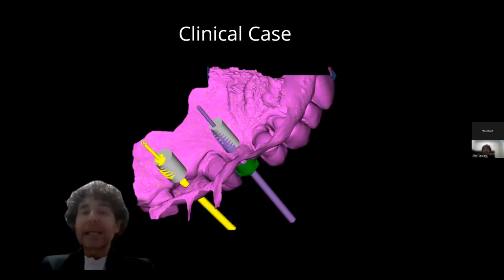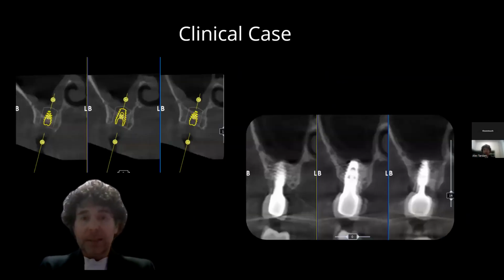Keep in mind that while for some this may seem a high value, the discrepancy between the plan and implant placement in freehand surgery is classically defined in the literature as being between 12 and 18 degrees, so about 5 times more than what we achieve using guided surgery. But that's the advantage of guided surgery. Now let's look at the advantage of using magnetodynamics.